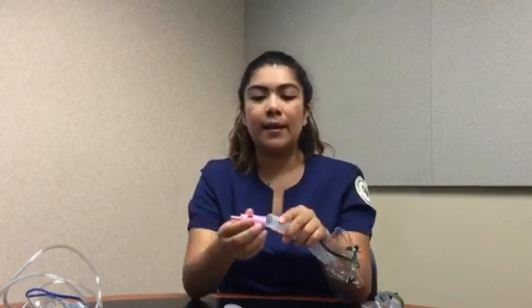So you just want to make sure that you get the correct ones. Don't just grab them by the color; that's not the best way to do it. You want to grab it and take a look at it, because you want to make sure you're giving the patient the proper FiO2 that they require. And then you just place it on right here.